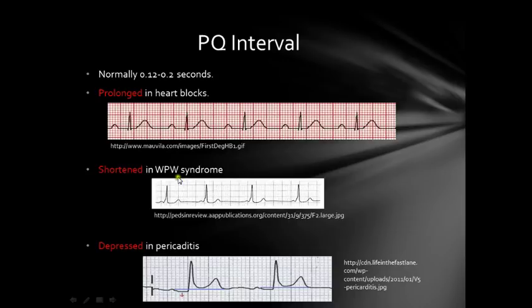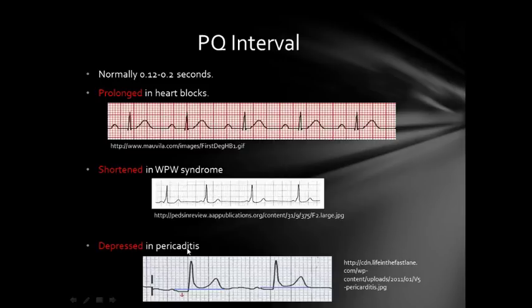The PQ interval is shortened in conditions such as Wolff-Parkinson-White syndrome — you can see right after the P wave comes the Q with barely any distance between them, so this is a shortened PQ interval, less than three small squares. It is depressed in pericarditis — the most typical example — and depressed PQ interval is very specific for pericarditis. You can see here the PQ interval is depressed.